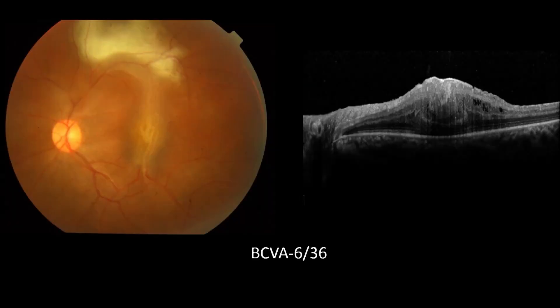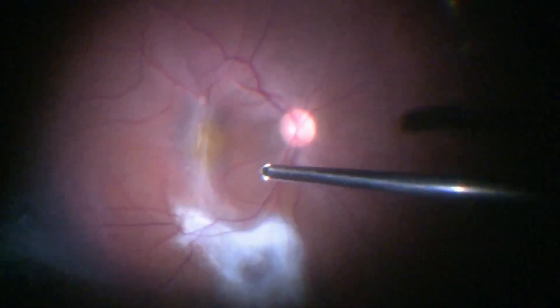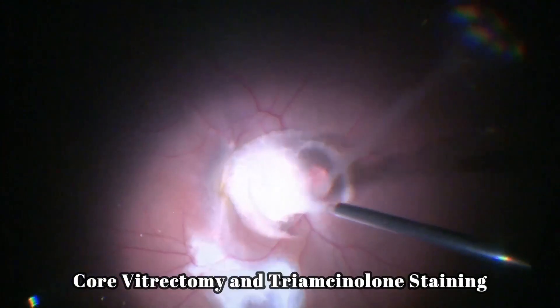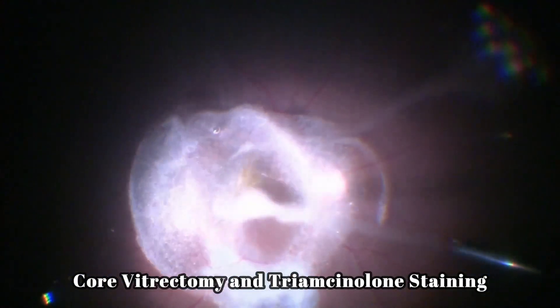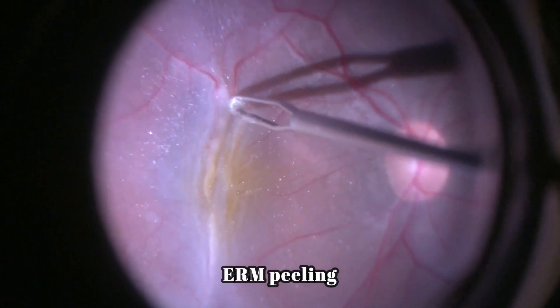Next case is an epiretinal membrane following a toxoplasma scar. You can see a thick membrane which has formed due to the scar of a previous toxoplasma infection. Vitrectomy is carried out followed with triamcinolone injection. Residual crystals are absorbed and then forceps is used to start peeling the membrane.